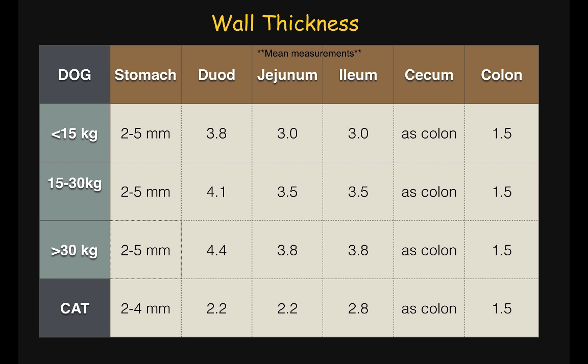Most disorders tend to affect the size of an organ or structure, and therefore reference values will be part of what we will be looking for while we evaluate the GI tract. To navigate through this table made of recently reported mean thickness measurements, I will start with the stomach.